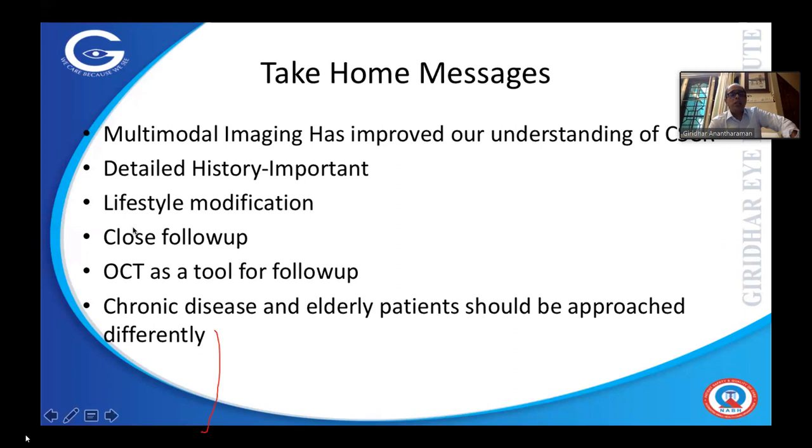OCT should be used whenever they come for a follow-up, because that tells us about the condition of the eye, the intensity of the disease, and whether it's really responding to your treatment. And finally, chronic disease and elderly patients should be approached differently. As I told you, the indications are in ICG angiography, OCTA, and probably treatments like photodynamic therapy. Thank you all for your kind attention.